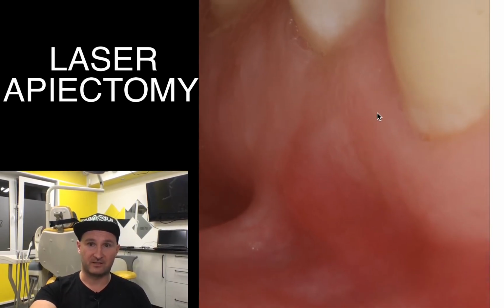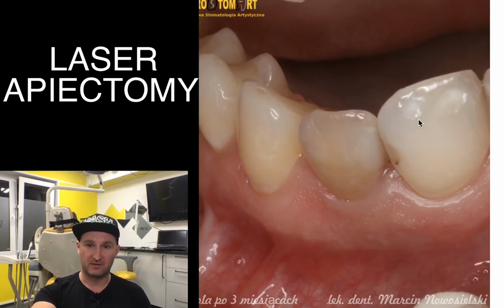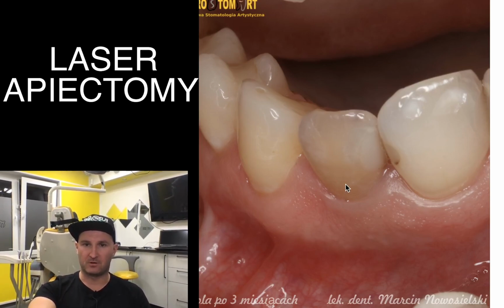clinically. As you can see, there is almost no scar, an area of vertical incision. We did not cause any loss of the papillas. We did not cause any recession here in operated area. So I think from the point of view of soft tissues, entire protocol was succeeded.